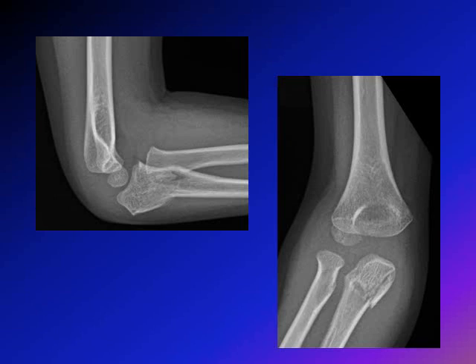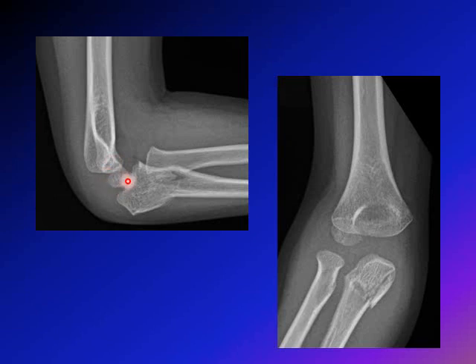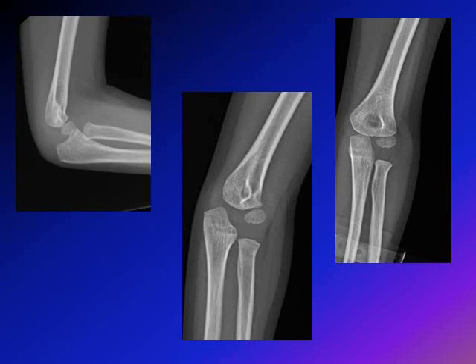This is an x-ray of a three-year-old boy who fell down on his elbow and presented to the ER with a swollen, painful elbow. You can obviously see the fracture here of the proximal part of the ulna — very proximally, affecting the part called the olecranon. However, if you look closely at the radius, the radius should have a different relation with the capitellum. This piece of bone is part of the distal humerus, and this is the capitellum, which is the part that articulates with the head of the radius.